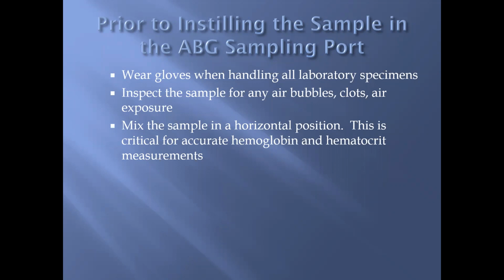Yeah. But then even if they're doing it like this, don't they put it in the blood gas analyzer, and then the blood gas analyzer mixes it? So that'll correct what happened with the red blood cells settling. They don't even really need to be doing it. Right. It's probably habit. Oh, no. So shaking, if there are tiny air bubbles in there, it's going to just bring the air bubbles together and make one big air bubble, and then you're introducing air into the machine. So I would say no to shaking it.